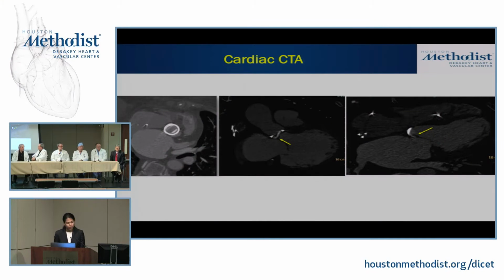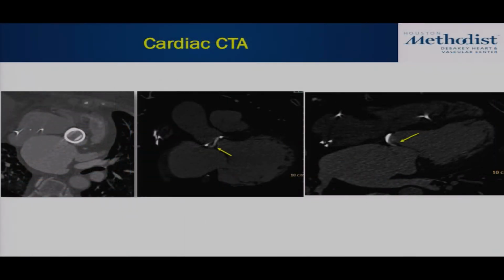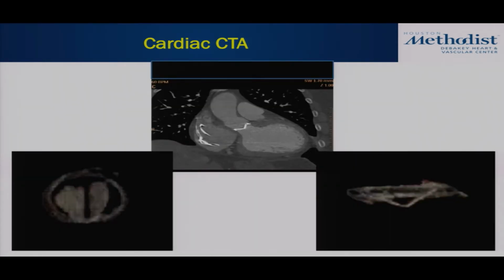Thank you. So this patient did undergo a cardiac CTA, and as you can see here, there's some periprosthetic hypodense material surrounding the valve, highlighted in the yellow areas, that was concerning for a pannus, and the Hounsfield units is consistent with a pannus formation, as Dr. MAHMARIAN had pointed out.